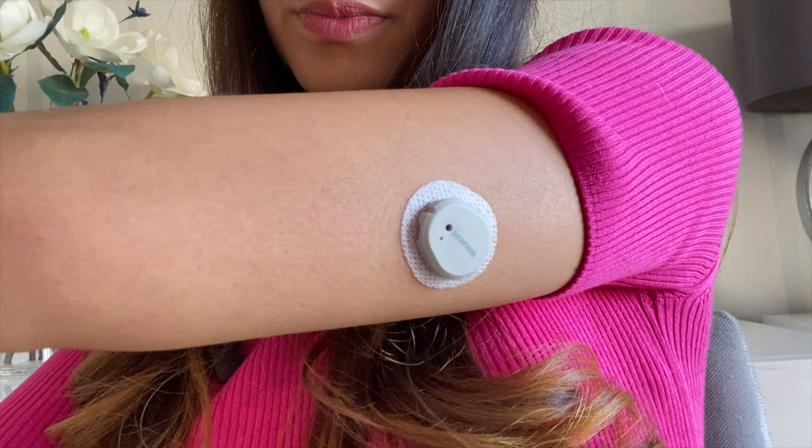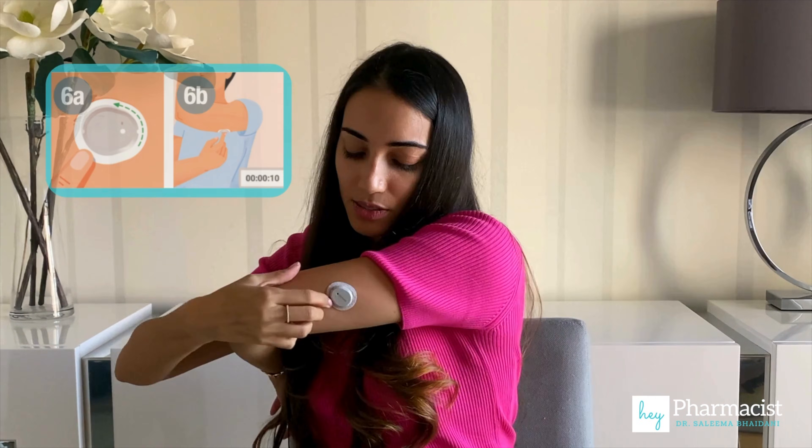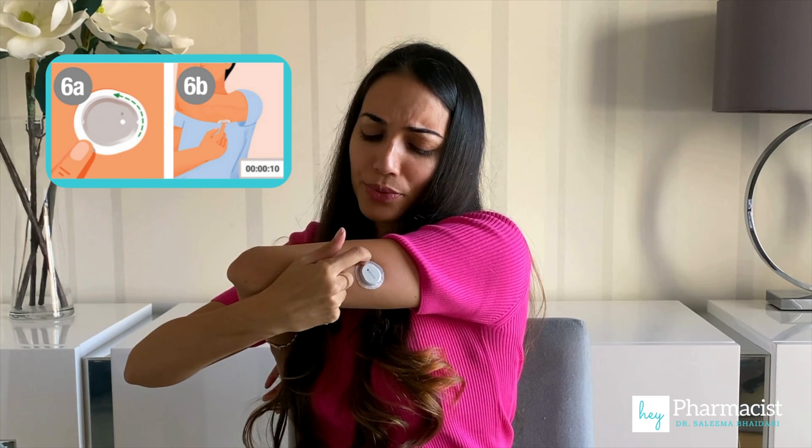After you've inserted the sensor into the skin, rub firmly around the patch three times — one, two, three.